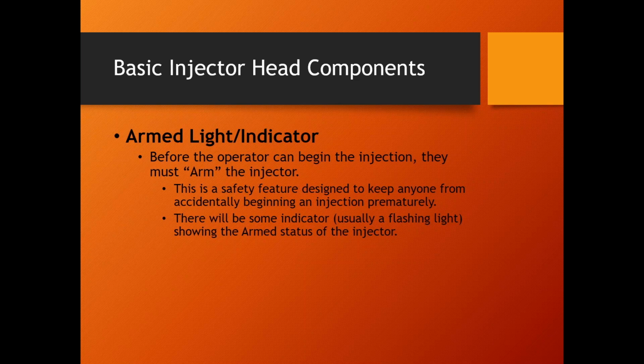These injectors, some of them go up to 4, 6, even 8 phases. I've never seen that long of a shot, but yeah, some of them will go up to 8 different phases. Now, when you're changing a phase, you're either changing the fluid, going from contrast to saline or vice versa, or you want to stay with the same fluid but you need to change the flow rate. Each one of those would require a new phase.